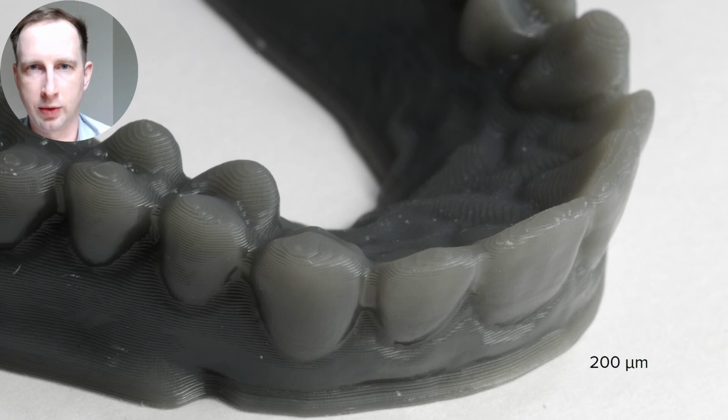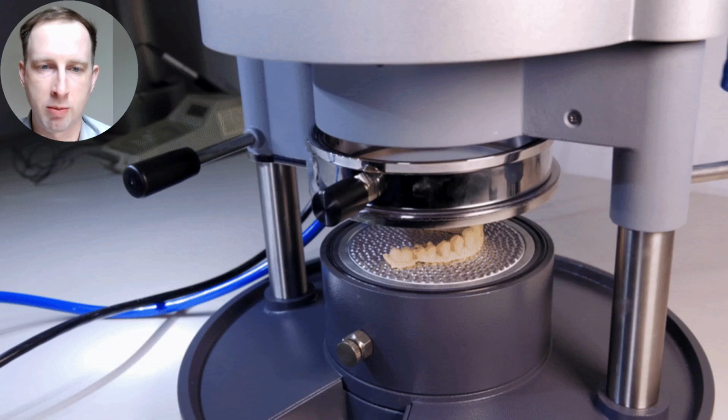Like, is it going to work for this application in this orientation, for example? This is a macro photograph of a 200 micron print, actually one of the first ones I did many months ago. And as you can see, the facial anatomy, even at 200 microns, was absolutely beautiful. I was kind of blown away when I first saw the model.